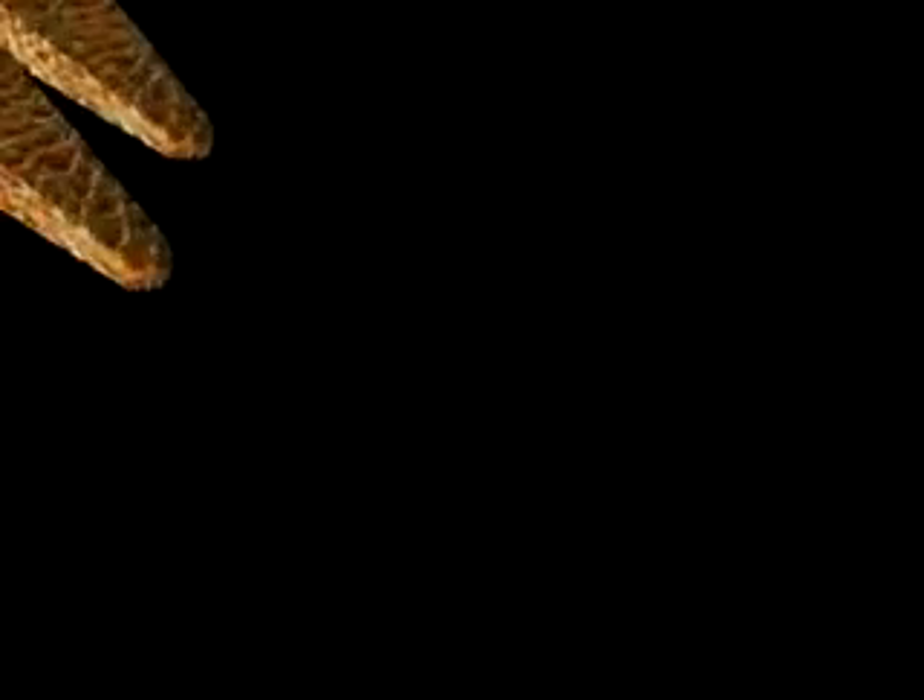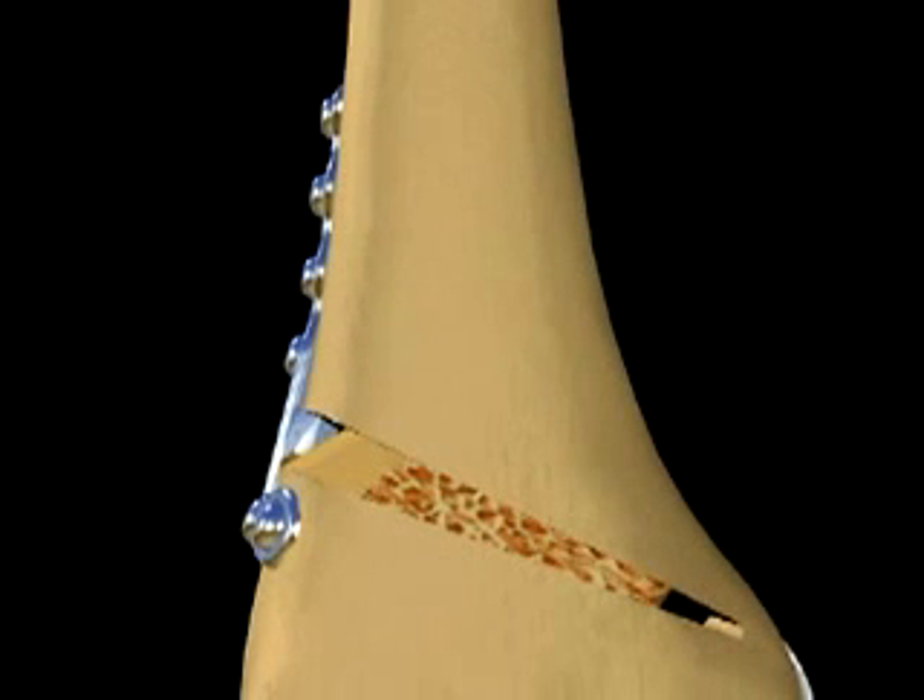Once the plate is secure, cortical cancellous allograft bone wedges available in pre-cut 17.5 millimeter widths are an alternative to autogenous tricortical bone graft harvested from the iliac crest. The graft is used to further fill the defect. The final X-ray confirms a re-established normal mechanical axis of the leg with the opening created by this technique filled with bone graft.